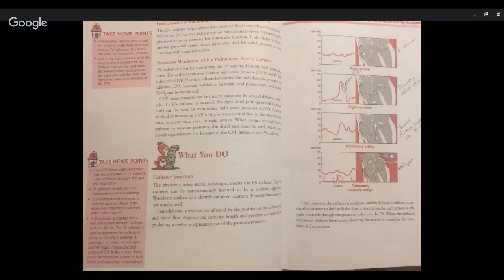CVP can be directly measured by several different methods. If a PA catheter is inserted, the right atrial port, the proximal injectate port, can be used for monitoring right atrial pressures, CVP. Another method of measuring CVP is by placing a central line in the inferior vena cava, superior vena cava, or right atrium. When using a central venous catheter to measure pressures, the distal port must be used, which more closely approximates the location of the CVP lumen of the PA catheter.